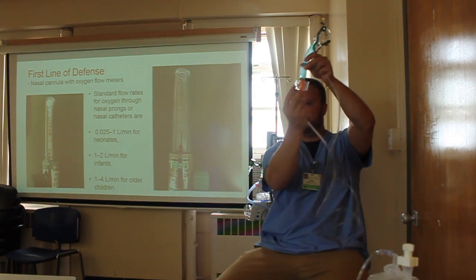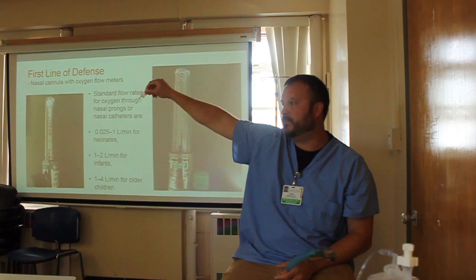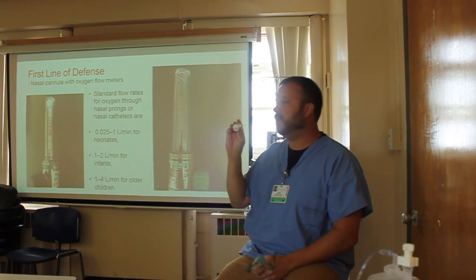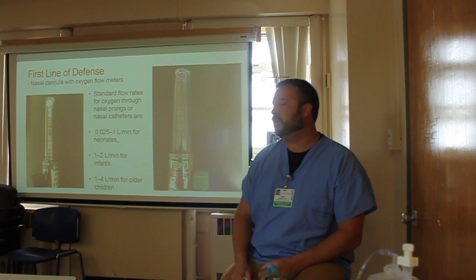There is a little entrainment device that's right here, can you guys see that? And that's attached to these little guys that allows so much air to come from just room air. And so now that is entraining in there. So we're giving a precise amount of flow or oxygen at a higher flow rate to get to your patient, okay?